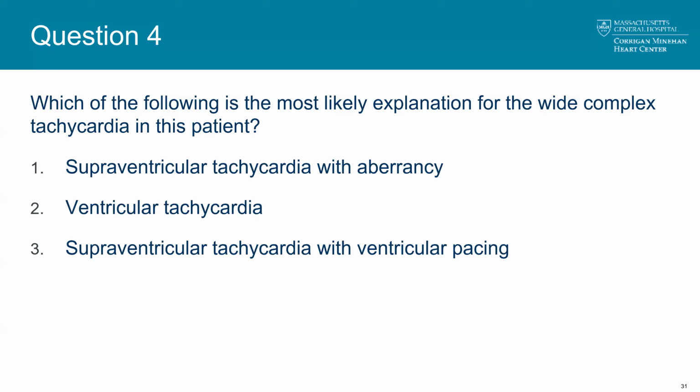Yeah, again, I think the more systematic you can be, the better off you're going to be. Because let's face it, when you're reading an EKG, there are numerous opportunities to fail, right? You're looking at a very complex phenomenon, something that represents very complex electrical conduction, and every finding has multiple possible explanations, and you're expecting yourself to do it many times per day and to do it really fast, right? And it's not necessarily a setup for success. It's easy to miss things, it's easy to be inconsistent, etc.